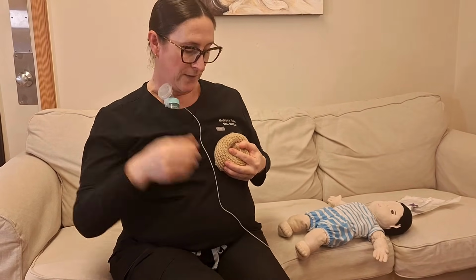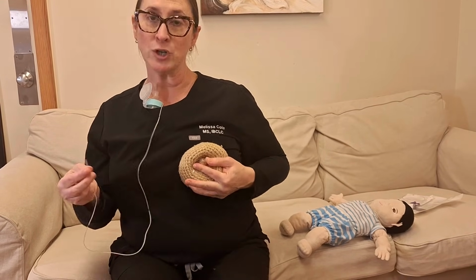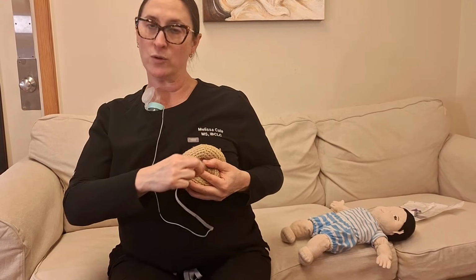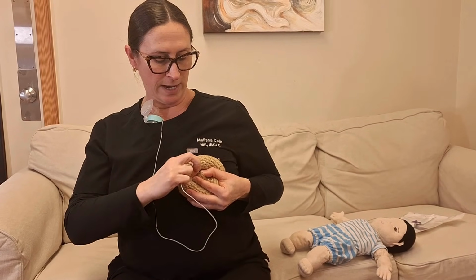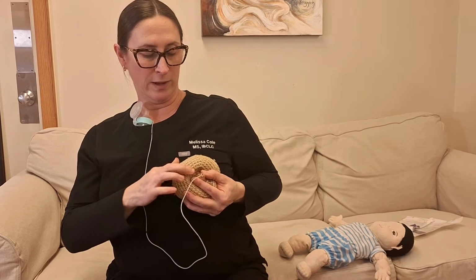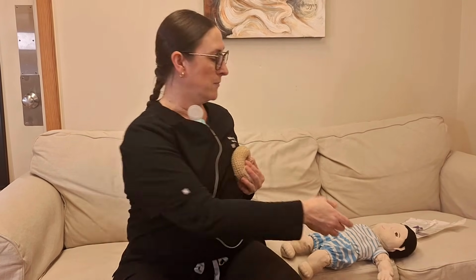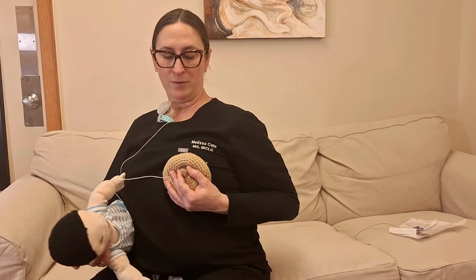And then we can take the tube device. Many nipple shields are different, but a lot of them have several holes in the front. We can find a hole in the front and poke the tube in through the opening. I just kind of hold it to the side. This way, the baby who requires a nipple shield can get supplementation as well. Just like latching to the nipple shield like normal, your baby can latch on, and then they get supplemented with the nipple shield in place.